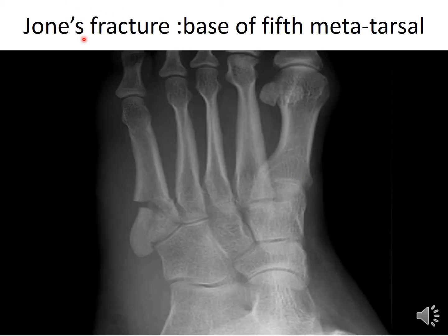Next is the Jones fracture. Jones fracture is mainly the base of the fifth metatarsal. So we can see here the fracture. This is the base of the fifth metatarsal, known as Jones fracture.